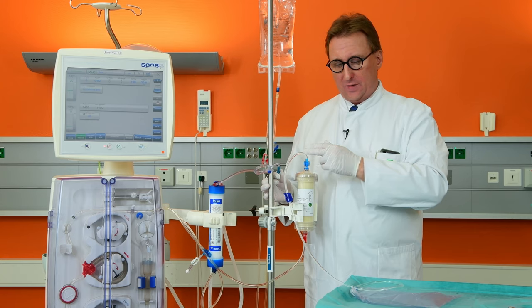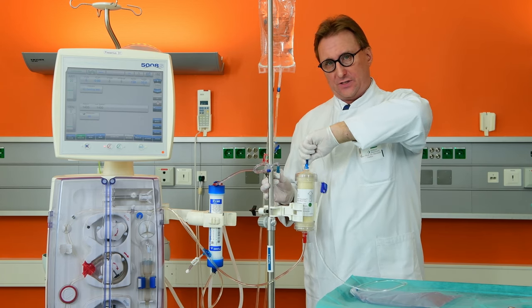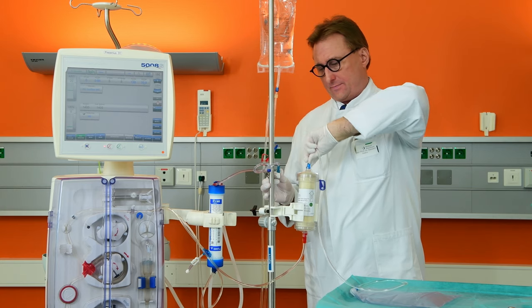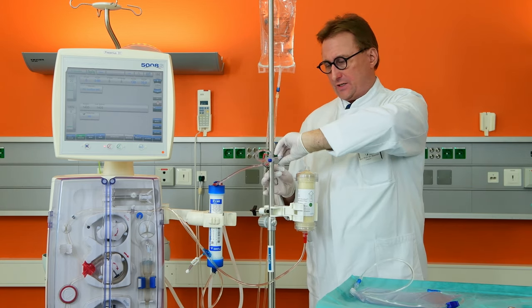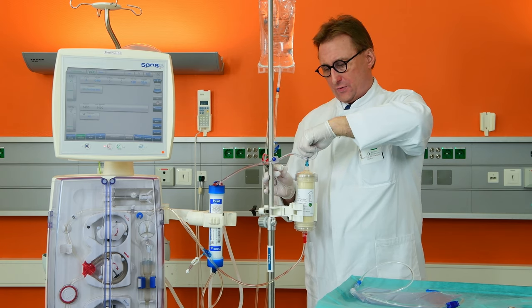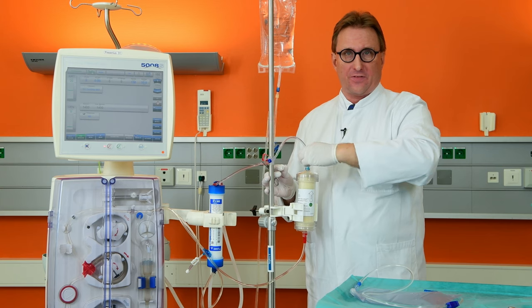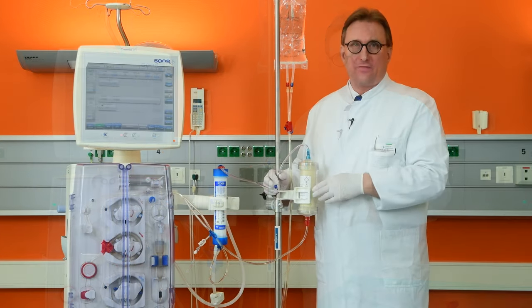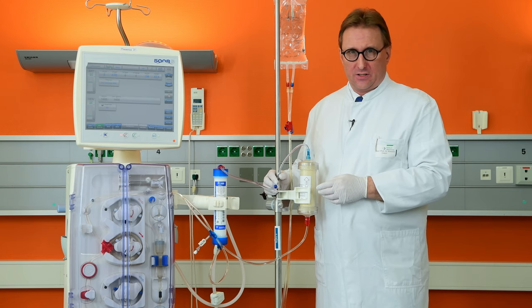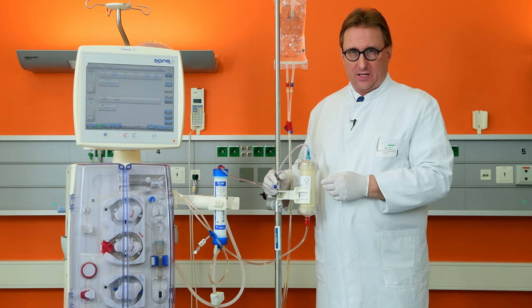Now disconnect the tubing and discard bag used for de-airing and flushing the system. Then connect, in no-touch technique, the venous port of the Seraph with the arterial port of the dialyzer in series. We have now finalized the preparation of our Seraph blood affinity filter combination with a standard dialysis machine.